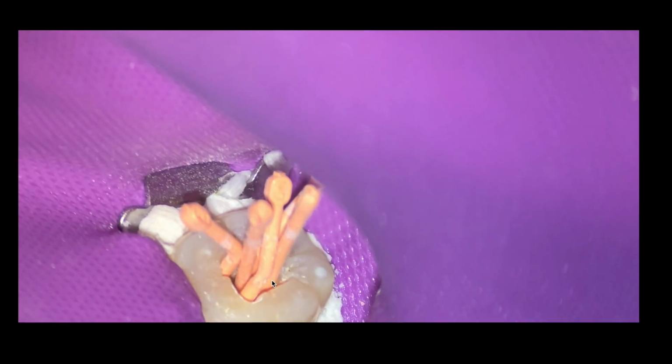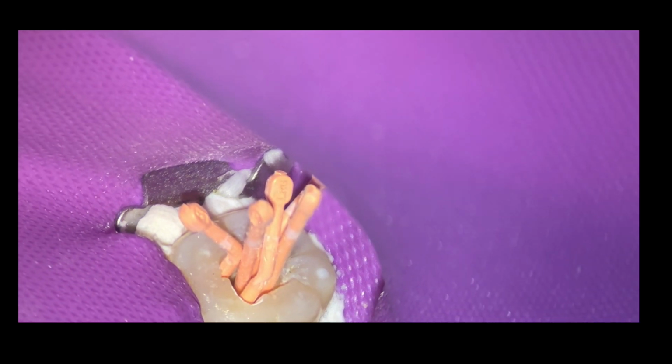And then what we're going to do is take a radiograph. I'll take the radiograph with the patient laying down. I don't even really keep the rubber dam on. This is one of our straight on. Well, it's kind of a shift shot, so I'm happy with the length. You can see we're within 1 millimeter of the radiographic apex, which would be kind of here, I'm assuming, and same on the distal. So I'm really happy with that outcome, and we've got a fill here.